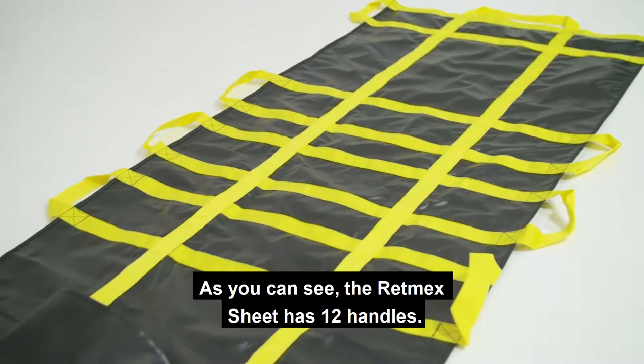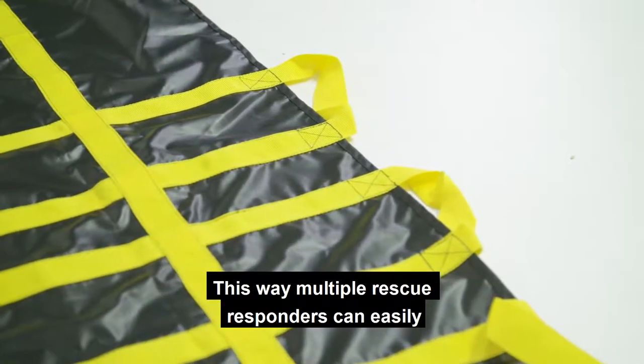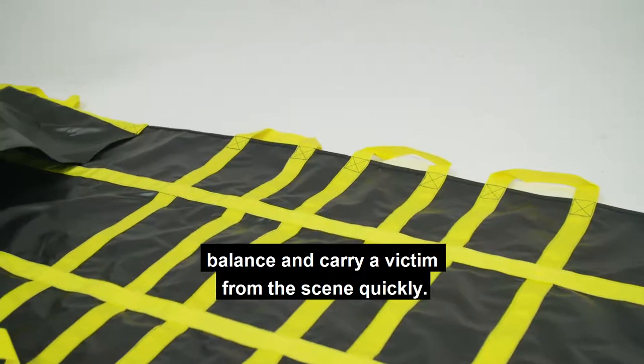As you can see, the RETMEX Sheet has 12 handles. This way, multiple rescue responders can easily balance and carry a victim from the scene quickly.